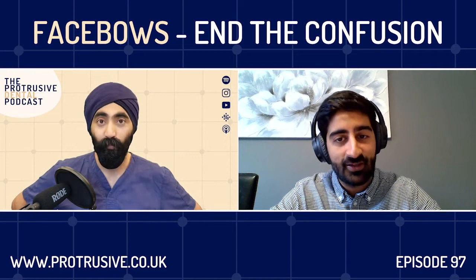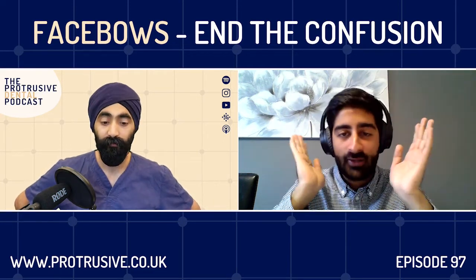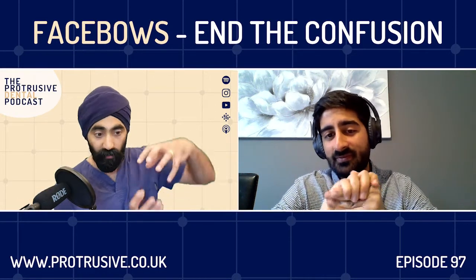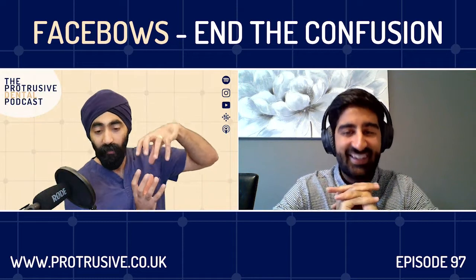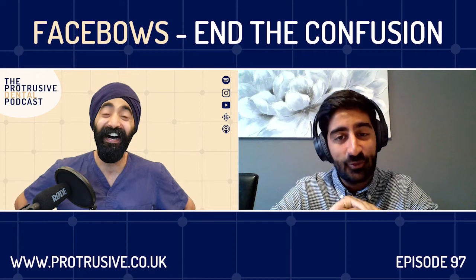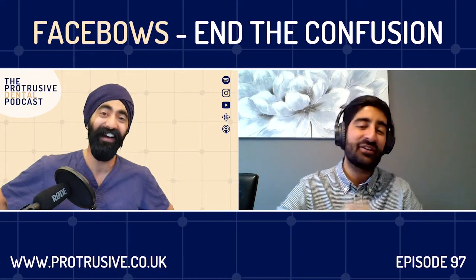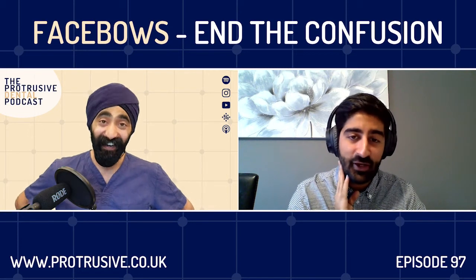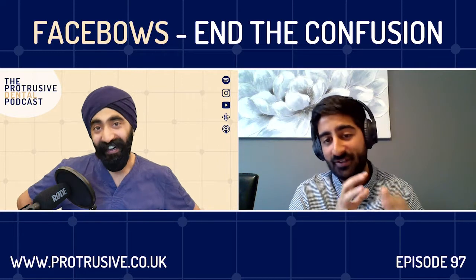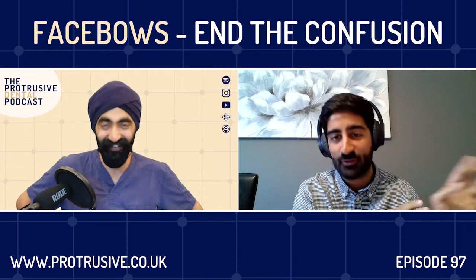The first type of articulator is a hinge articulator, which just goes up and down. It doesn't reflect the patient's jaw at all. It doesn't accept Facebow records. I mean, even more primitive than that, Salman, is the old wristiculator. But you know, Jazz, the evidence shows that the hand articulator is more accurate than the actual hinge articulator. So if I've got like a lower right 6 single unit crown, I'd rather my technician mounts it on his hands and figures out the excursions rather than puts it on a hinge articulator, because that just has no relationship to what happens in the mouth whatsoever.